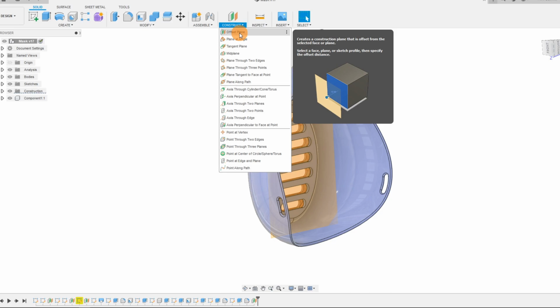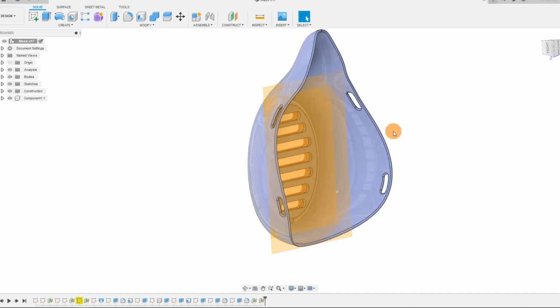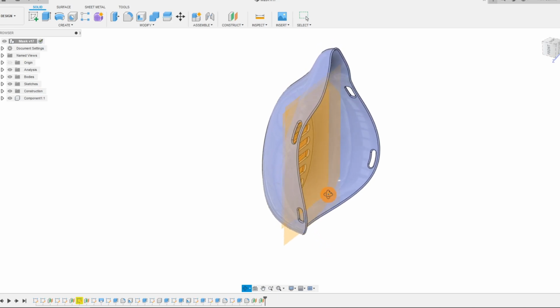And I'm going to construct an offset plane from this plane. And this one is going to move about 0.2 of an inch, so negative 0.2. And hit OK for that. And now we have our two planes.